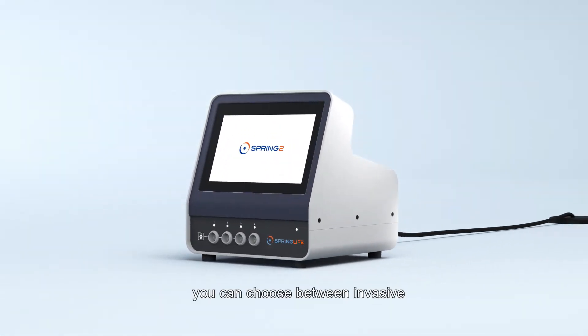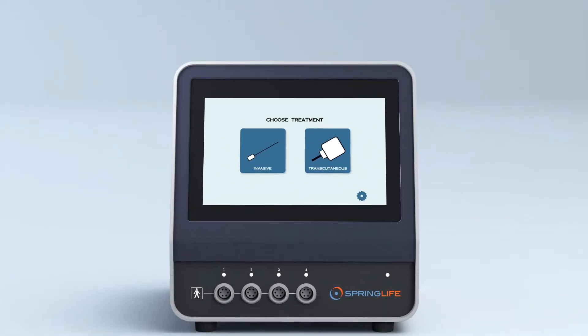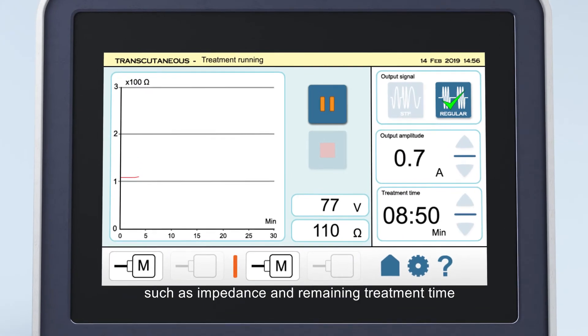After starting up the Spring 2, you can choose between invasive and transcutaneous treatment. During a procedure, the screen shows all the information you need, such as impedance and remaining treatment time.